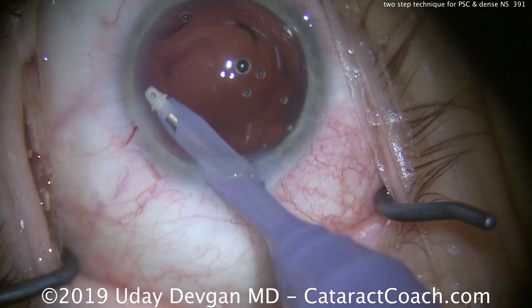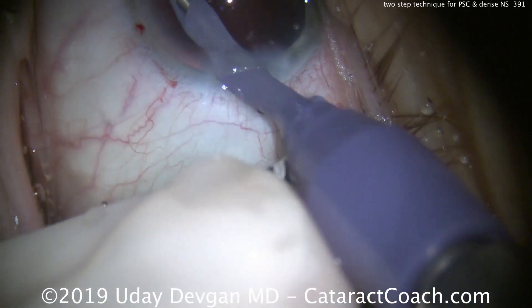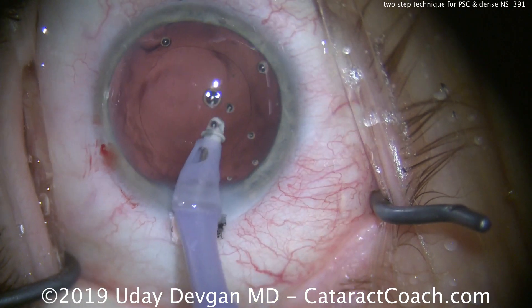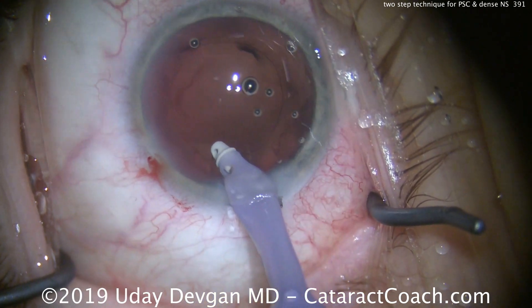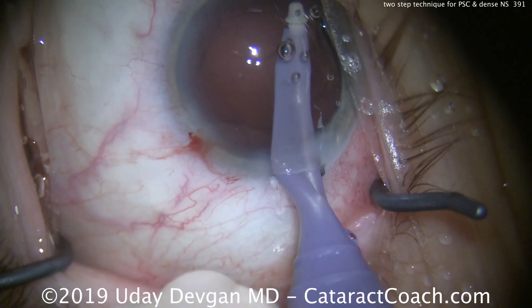This looks amazing. Our signature is our capsulorhexis and the incision, and in this case both are just beautiful. Finishing up — there's still some residual viscoelastic, which we'll remove at the end of the case.